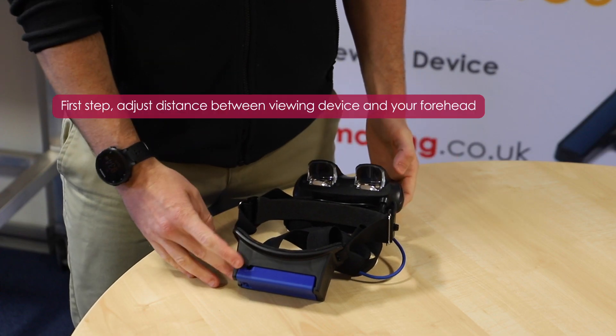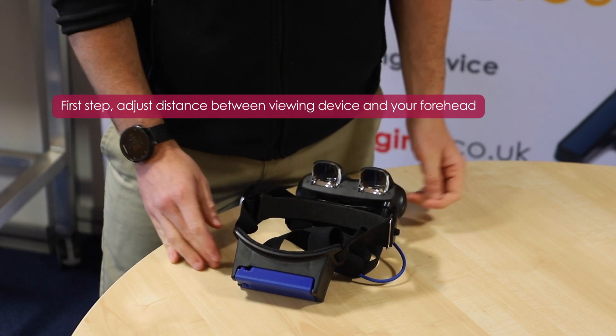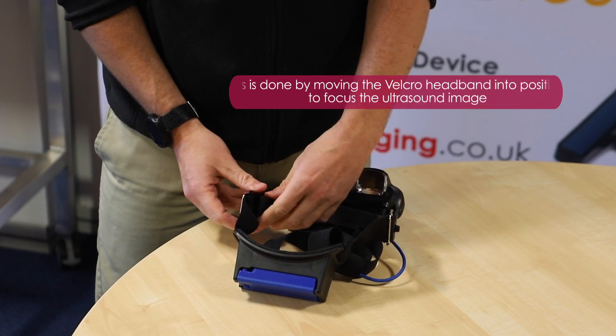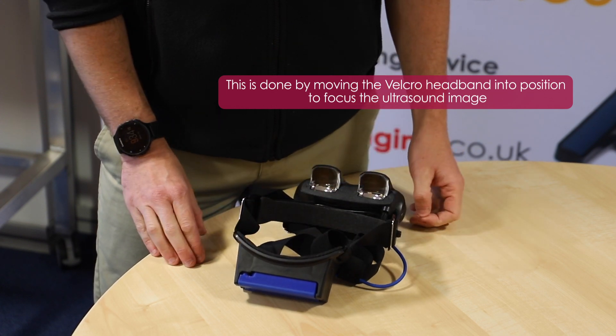The first step is to adjust the distance between the viewing device and your forehead. This is done by moving the removable headband using the velcro attachment to a position that allows you to focus on the ultrasound image being displayed.